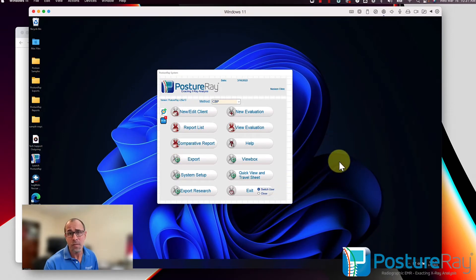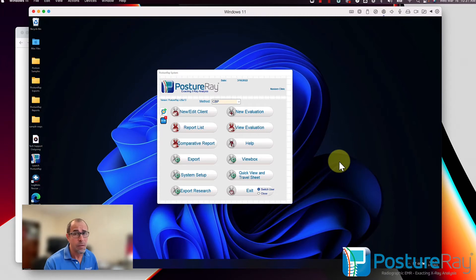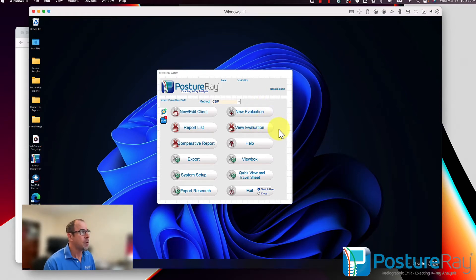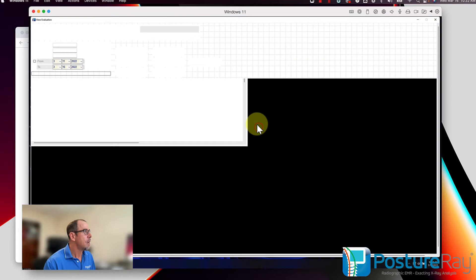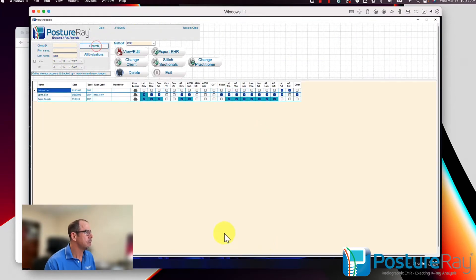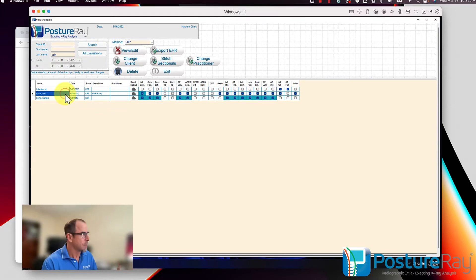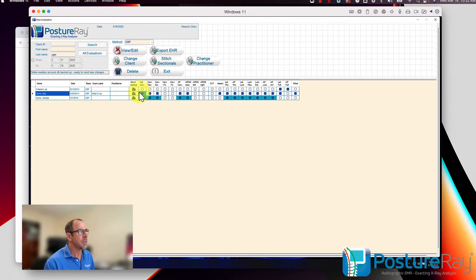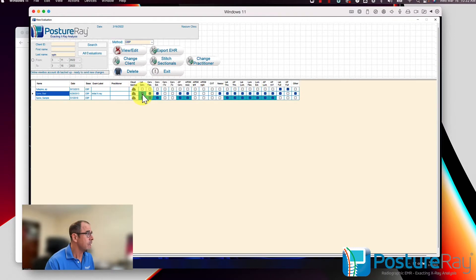The way it works is your X-ray software system sends the DICOM images to PostureRay, so you continue using those same software packages. You don't need to waste time drawing lines on film when you can digitize the X-rays in PostureRay and make those measurements mean something for objective documentation. A common question is whether you can load X-rays from a CD-ROM or DVD — of course you can. You can also load DMX videos because we even do lateral bending and AP open mouth. I've already pulled in a patient — Mr. Bad Spine has some X-rays — and the lateral cervical has yet to be analyzed, so let's start with that.